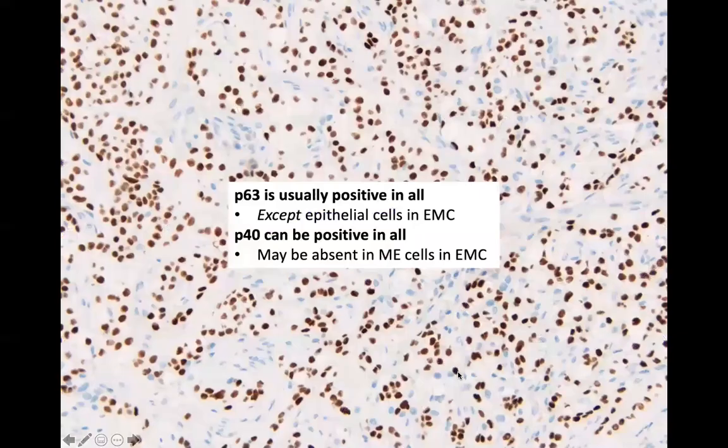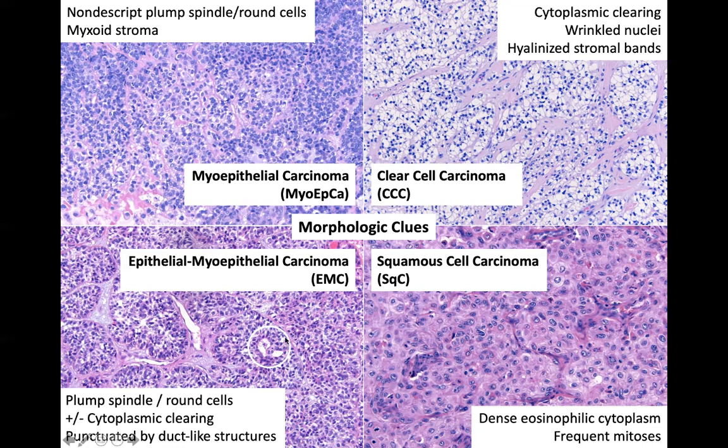And so these are all here together because they essentially all stain like they could be squamous cell. So they all have P63 and P40 positivity. Of course, if you're an epithelial myoepithelial carcinoma, you're not going to have P63, P40 positivity in the ducts. But remember, in epimyoep, the vast majority of the cell population is actually the myoepithelial cells. The epithelial cells are sparse or scarce, okay?